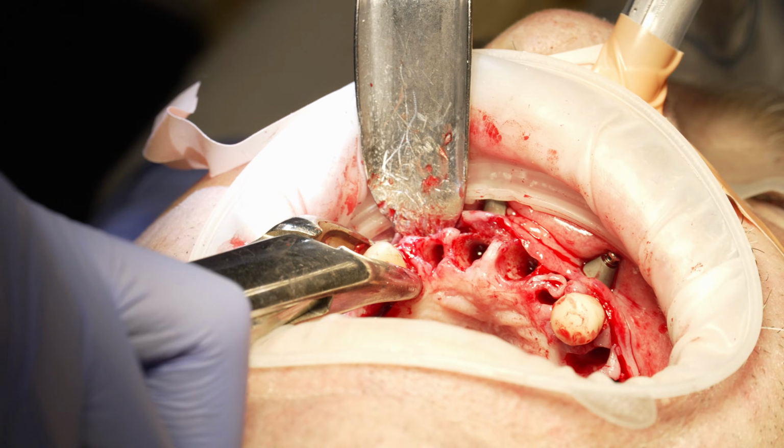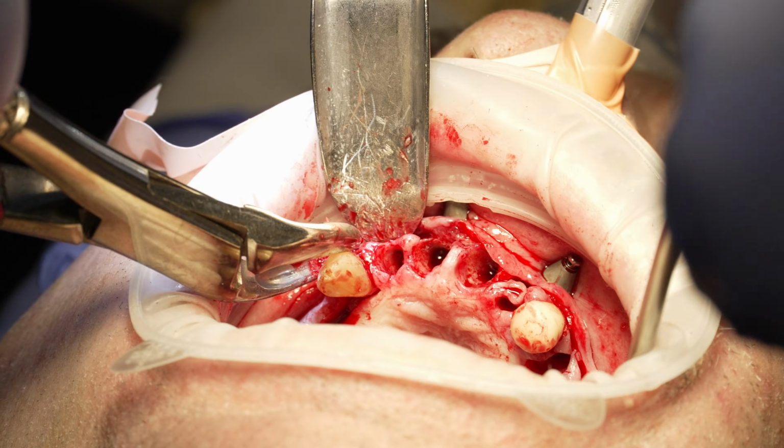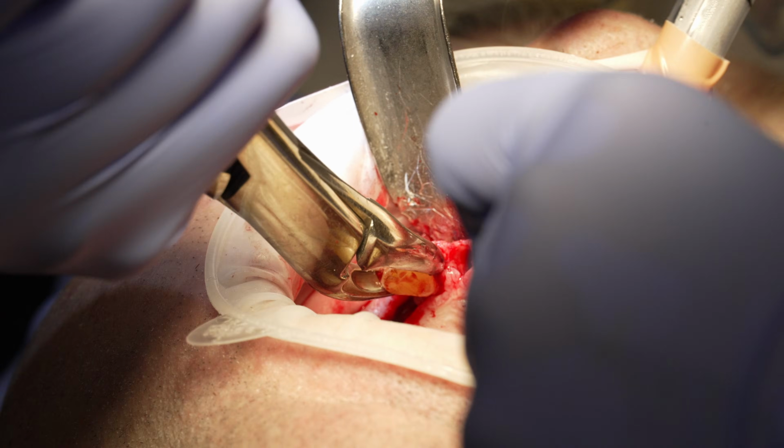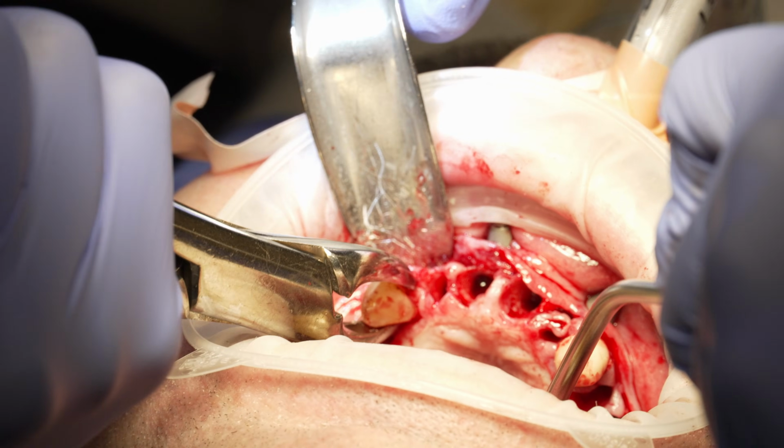And while most of them are coming out easily, there will be some a little more difficult, like the canines here. They always come out, but some will be a little more difficult and some obviously a lot more easy.